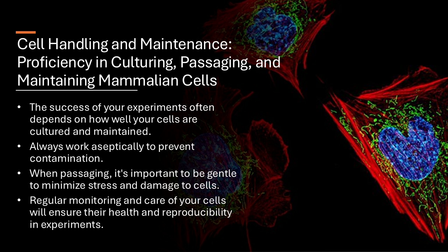Sounds pretty fancy. But speaking of keeping things pristine, I imagine contamination is a major concern. You're absolutely right. Contamination is a huge deal. Even the tiniest speck of bacteria or fungi can wipe out an entire culture. So how do you combat that? Sterility. Everything has to be perfectly clean, the workspace, the tools, every single thing. We work in these special biosafety cabinets and use strict sterile techniques. It's like operating on a microscopic level, right? Yeah. Every move has to be precise and sterile.